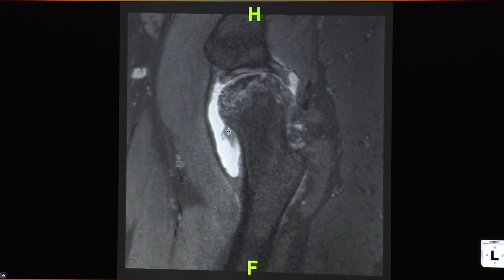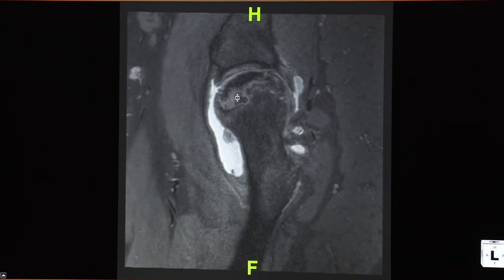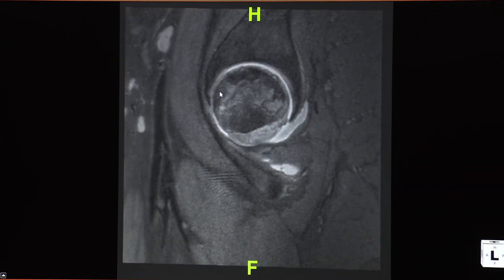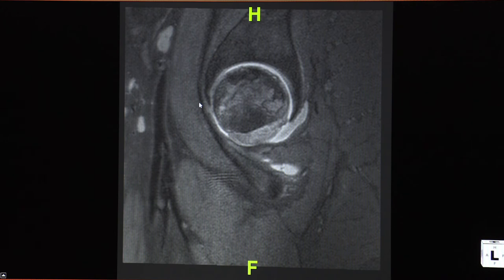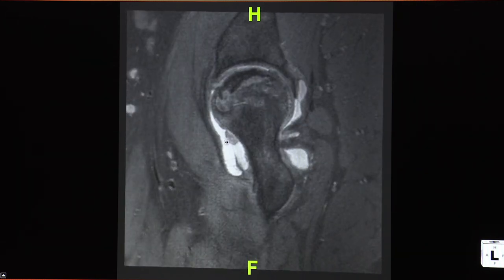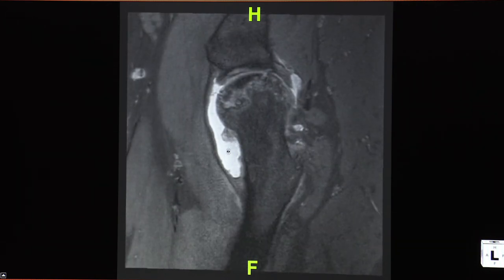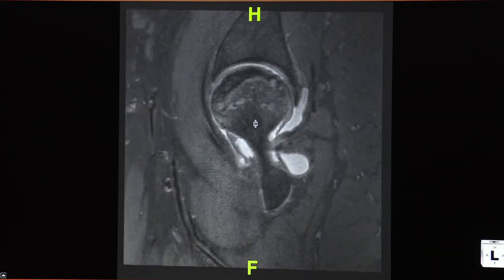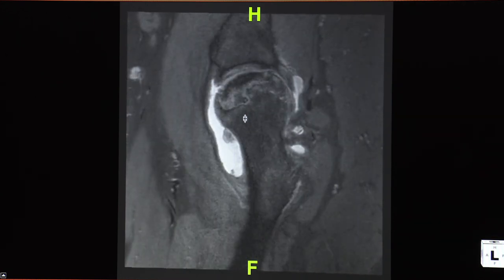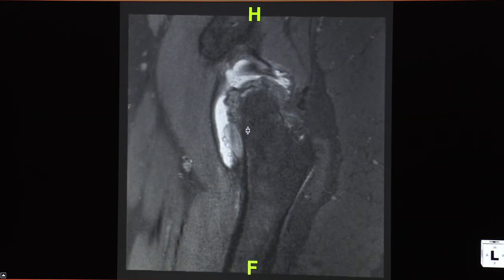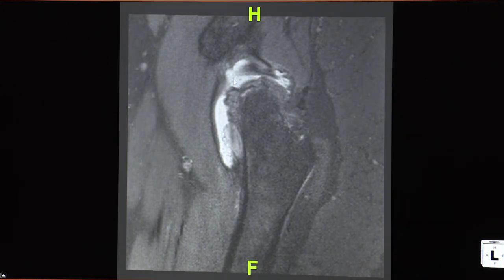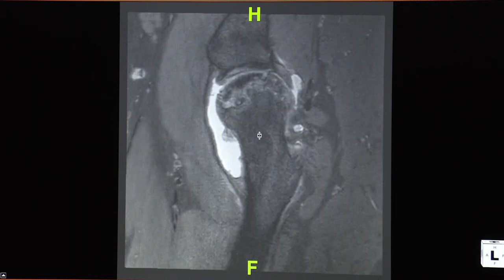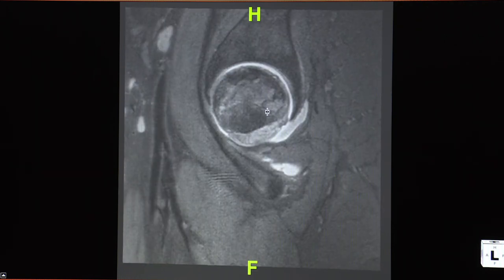When you come to this point, the labrum looks okay again. So it goes from where we first see the cleft all the way through — about 1 to 2 o'clock, consistent with what we saw on the other image. You can see multiple labral tears and measure them. In this case the hip will be replaced — it's already Ficat stage 3 — but the point is that you can see the synovial thickening quite well, details that are sometimes hidden in 2D images.